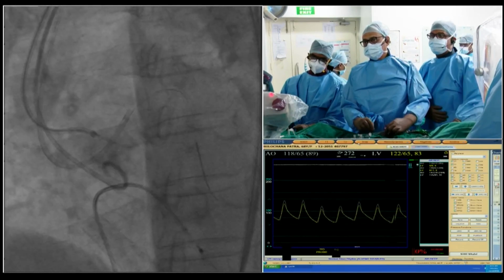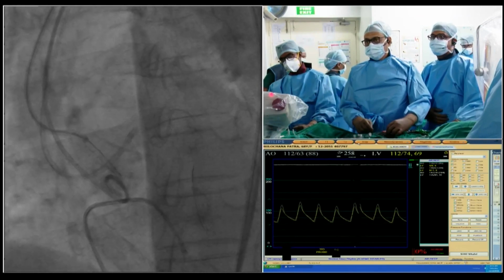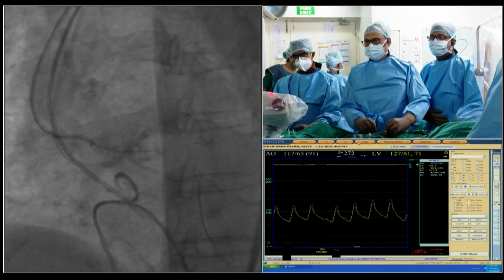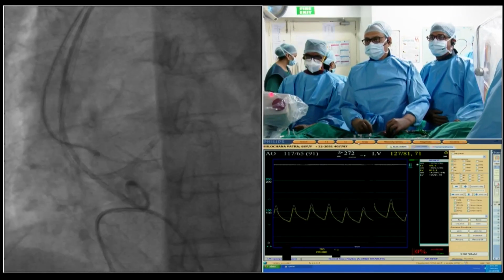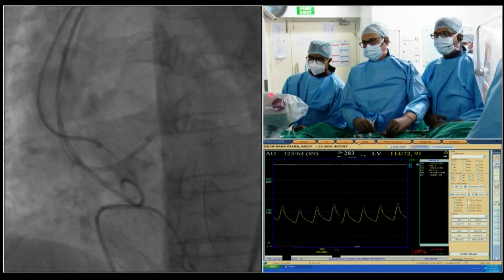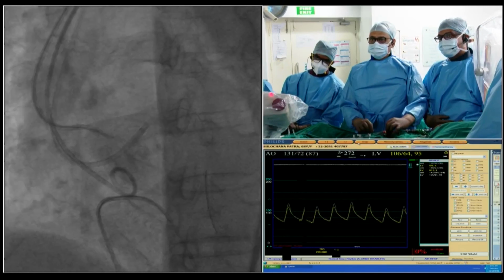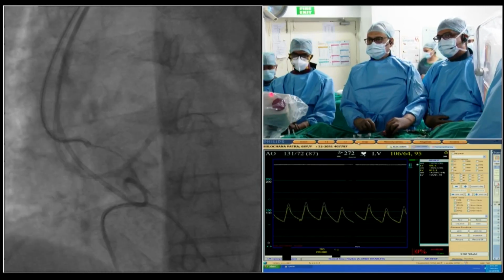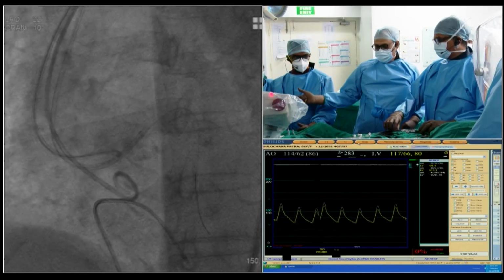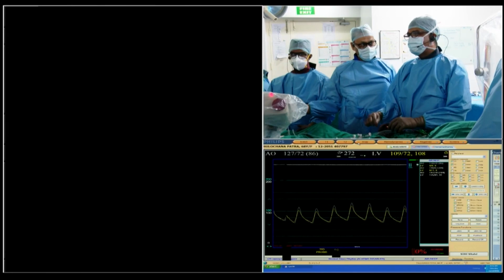AL2 we can take. So Manoj, while you, I'm sure, get your wire across, which you'll do in the next moment or two, we'll just go across and see what Praveen is up to. Sure, sounds good. Okay. And we'll do that, protect the right coronary as well. Yeah. Okay. Meantime, if you can hand over to get across to Gurugram. Yeah. We can take this out. So Adi Yadav here is recommending that you can actually get through to the.